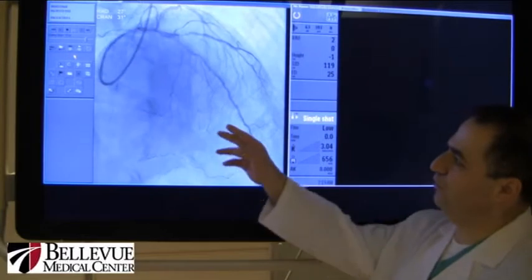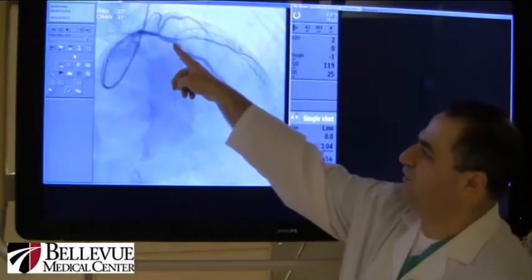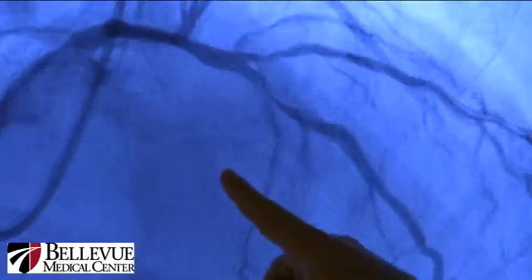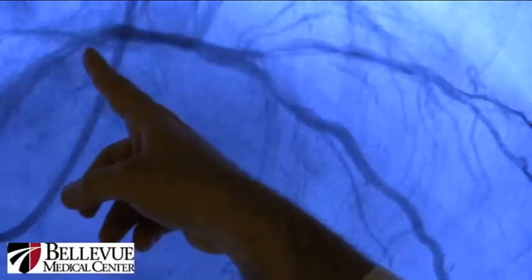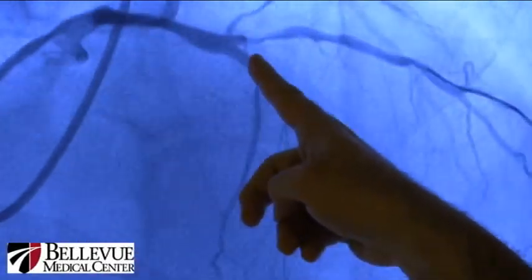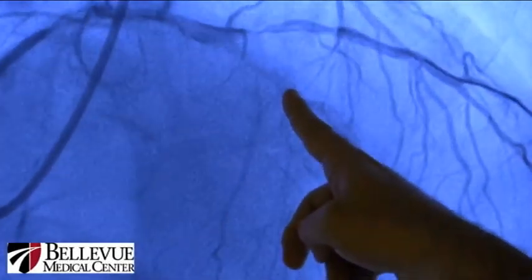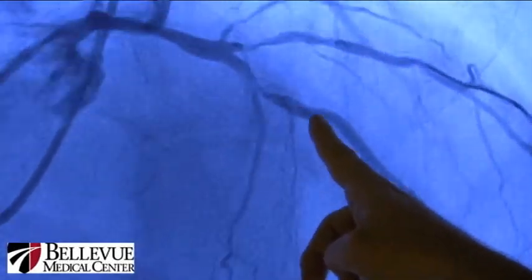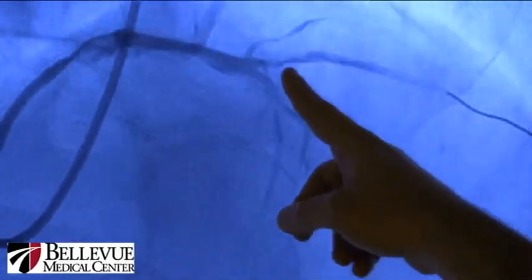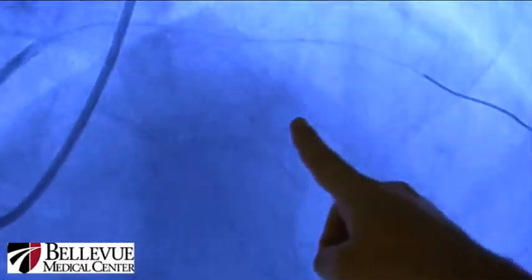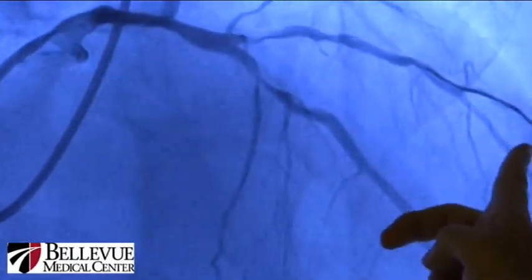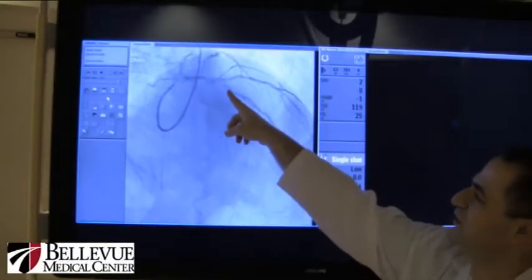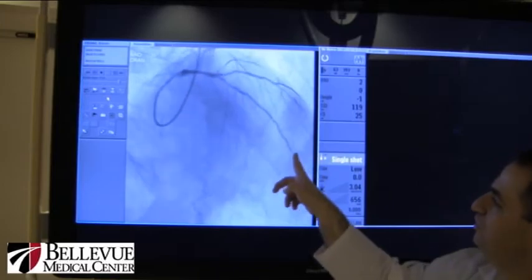This is a demonstration of the coronaries. This is the left anterior descending artery with the catheter inserted inside it. We can see significant narrowing in the mid portion of the left anterior descending artery and the first diagonal branch. These are the wires inserted inside the coronaries, and this is the stent inserted inside the coronaries.